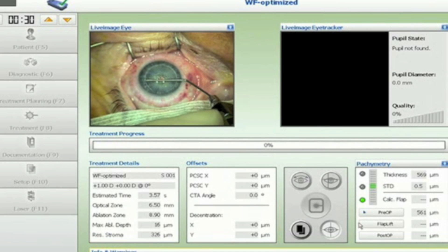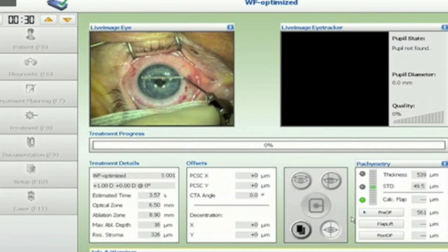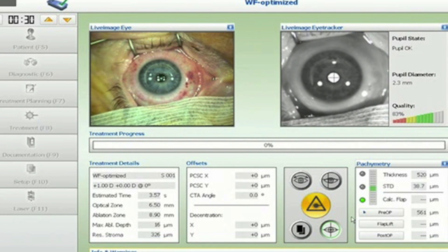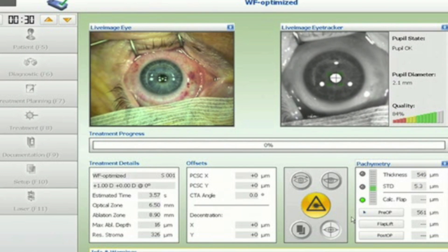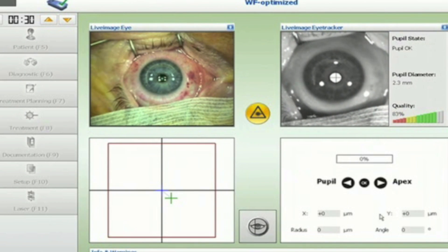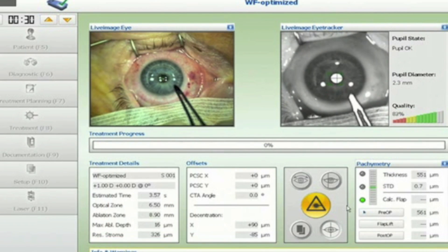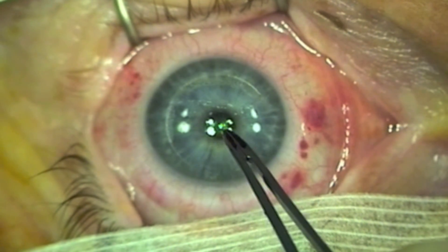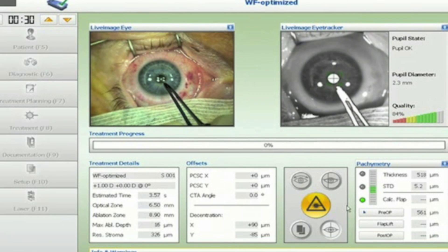Now under the EX500. With the use of the eye tracker, the right foot pedal is pressed, resulting in a red beam marking the cornea at the centre of the ablation. We decentre the ablation to usually halfway between the corneal apex and the centre of the pupil. Pressing the right foot pedal now marks the exact location of where the KAMRA needs to be centred. This point is marked with ink and the right foot pedal is pressed again to validate the ink mark.